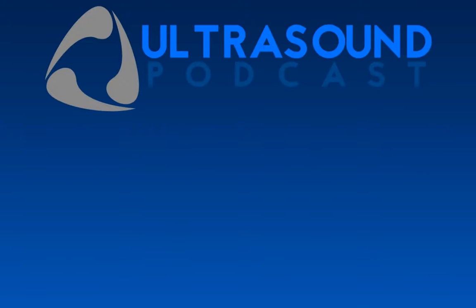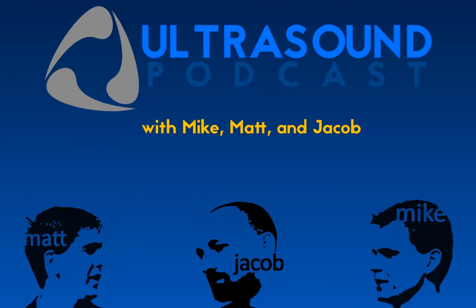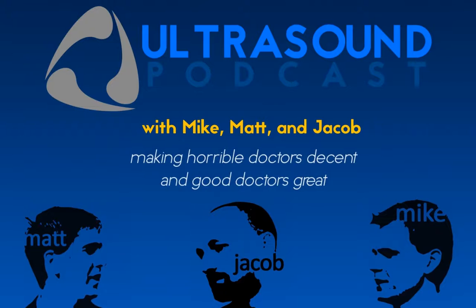If you're not good enough at ultrasound, that's not an excuse to punish your patients with radiation. Get out there, ultrasound some hearts, some lungs, some IVCs. Let us know how you feel about it. Yeah, we can definitely do that, or we could be better clinicians and use our ultrasound.